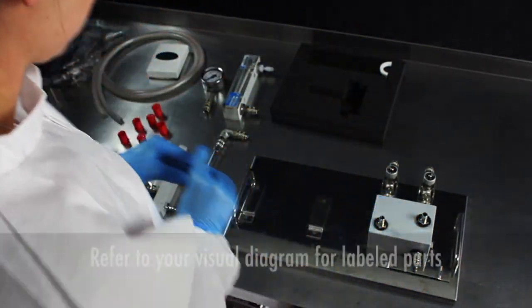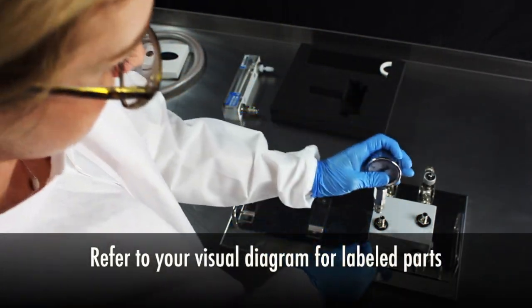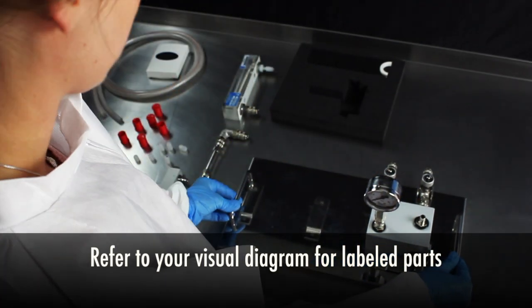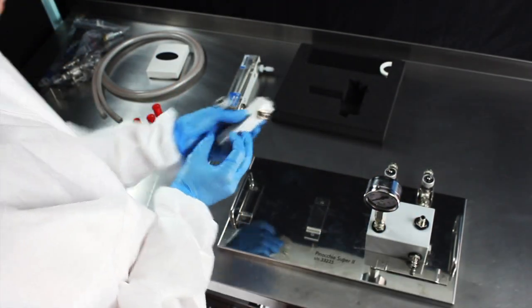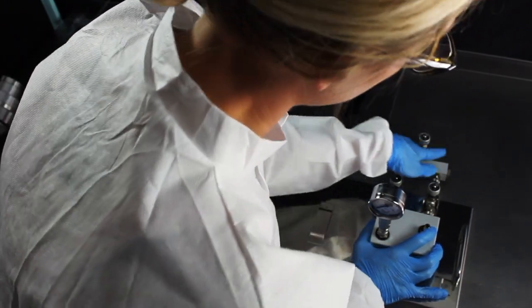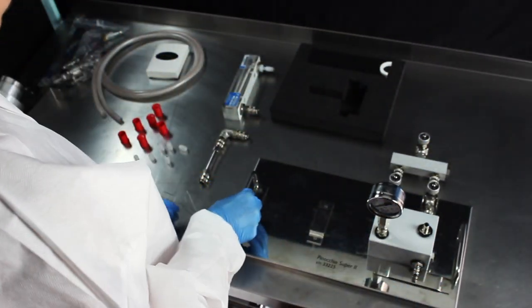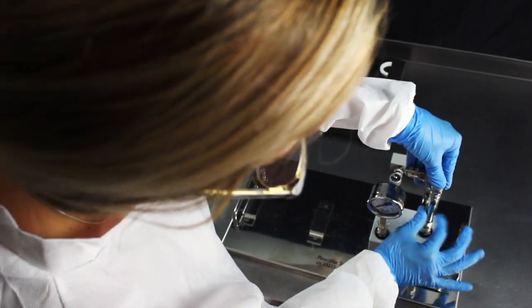Connect the pressure gauge to the top of the central block. Push firmly until you feel it click. Connect the air inlet connection to the back of the central block, then connect the air outlet connection to the top of the central block.